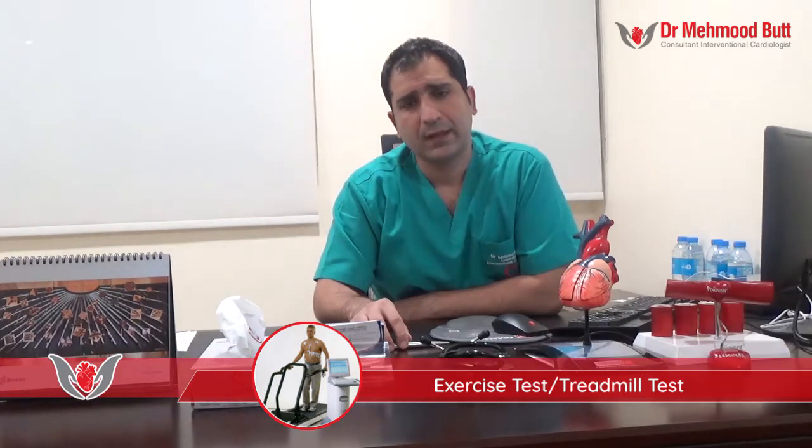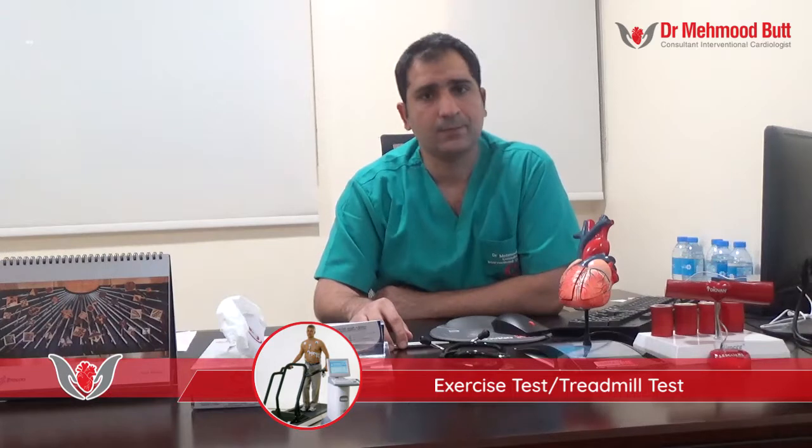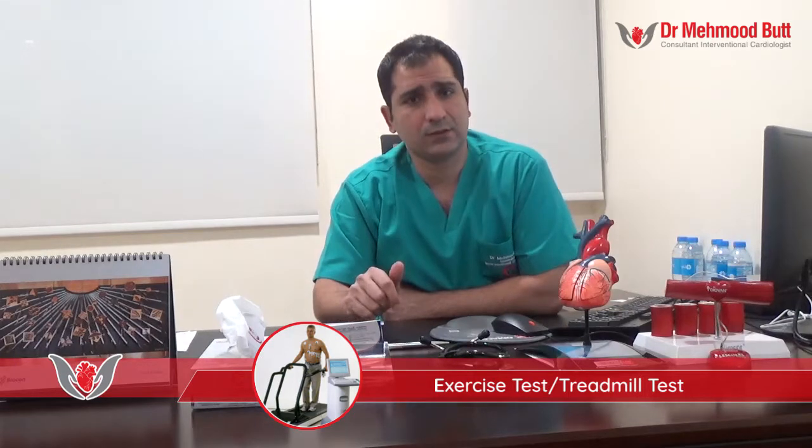At the end of the test, we will know if your ECG was abnormal at any stage of the exercise, or even after once you have physically recovered. The ECG machine and blood pressure cuff are then removed, and the results are passed to the cardiologist.